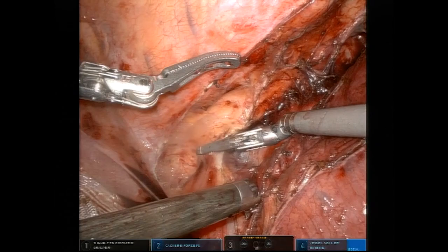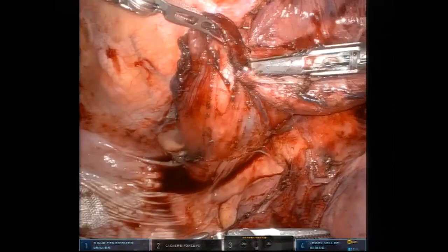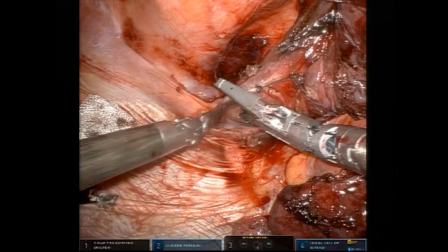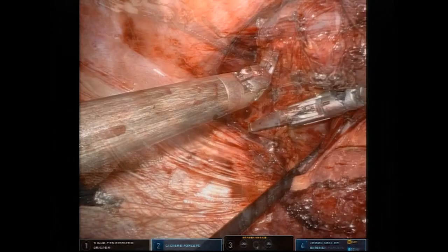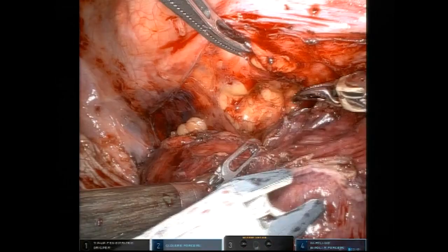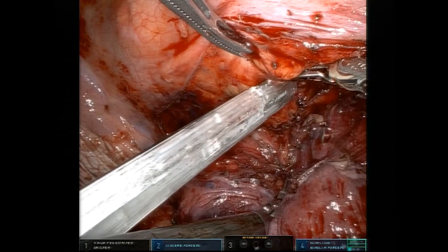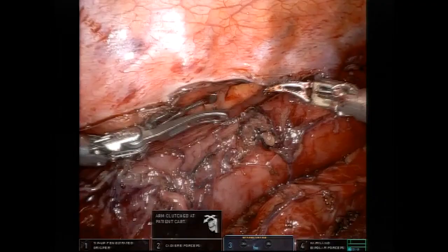The dissection is now carried inferiorly towards the hiatus, until the entire thoracic esophagus is fully mobilized. Next, we identify and clip the thoracic duct to reduce the risk of postoperative chylothorax. The fully mobilized intrathoracic esophagus is shown.